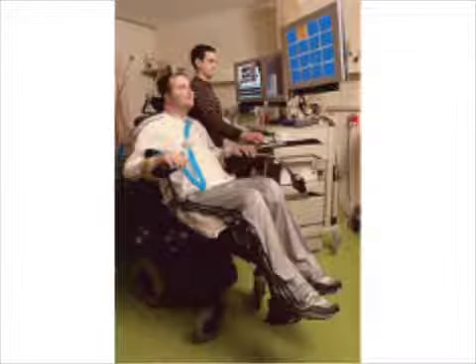Success with these types of experiments in animals led to human clinical trials with paralysis patients. In a similar experimental setup, a human patient with tetraplegia has a multi-electrode array surgically implanted in his motor cortex. The firing of these neurons is then processed by an algorithm that allows the patient to operate a computer cursor in real time. At the beginning of the experimental process, the patient was asked to imagine moving the cursor and was provided with visual feedback that helped improve performance.